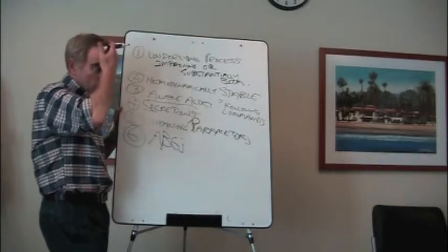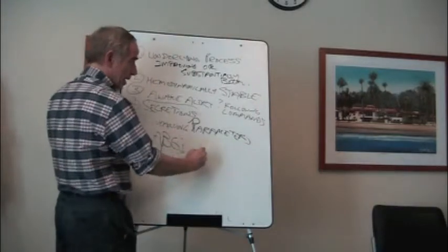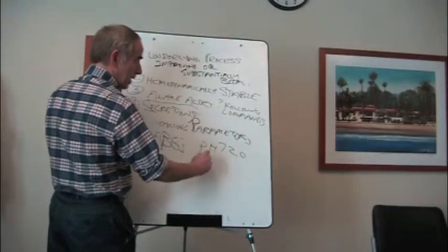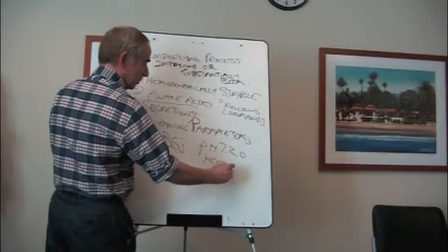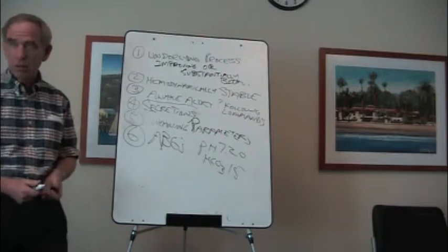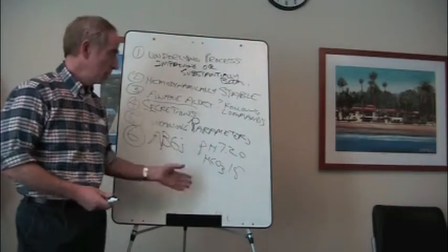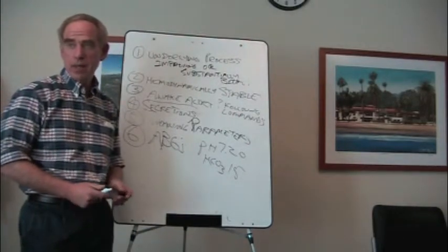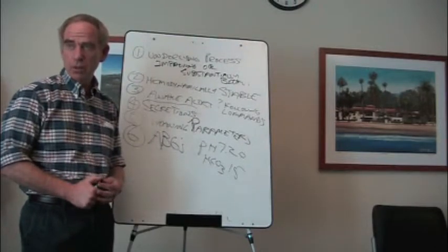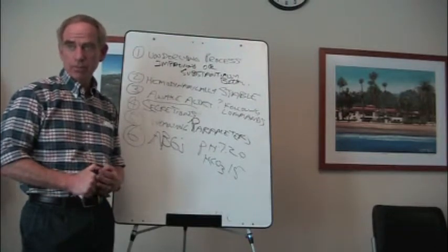If it's not, what's going to happen? So say my pH is 7.2. Say I have a metabolic acidosis. Are you going to be comfortable extubating that patient or trying to get him off the ventilator real soon? Why not?